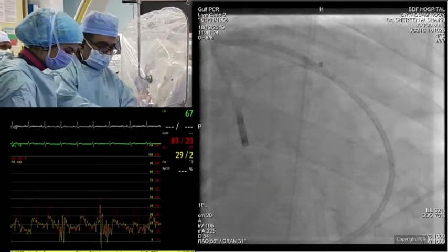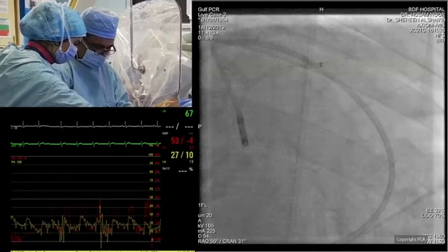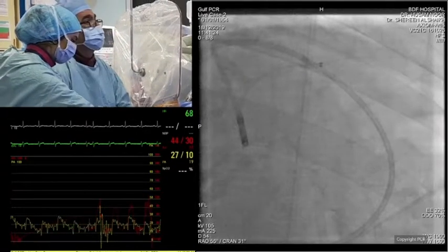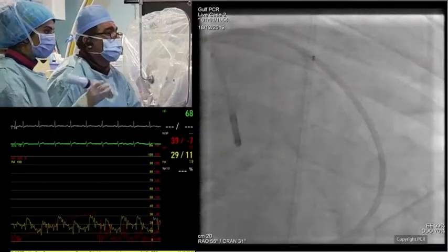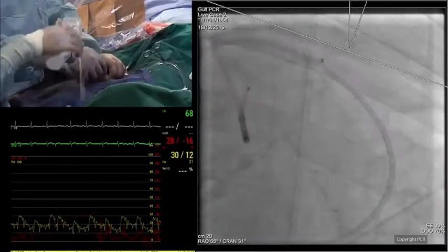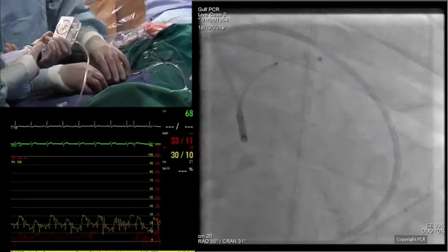Ibrahim, Jan, what is the downside of just simply, because you are anticipating that the long stent with this acute bend will give you a little bit of difficulty, doing just two stents, like going distal and then coming proximal and overlapping with two shorter stents? What's the downside of doing that?